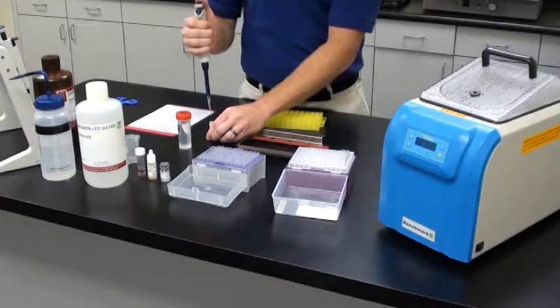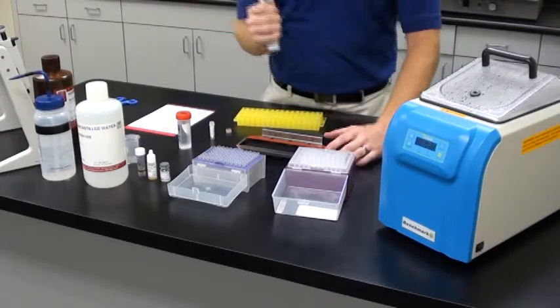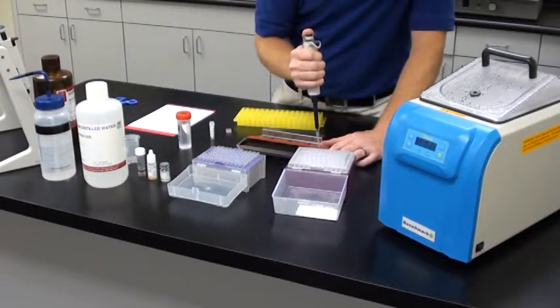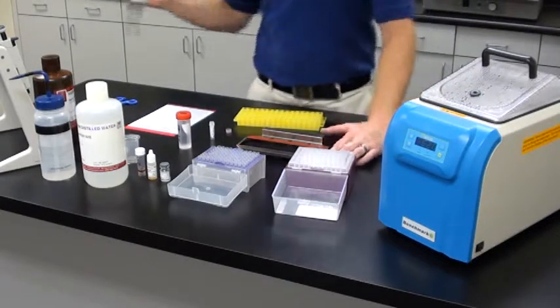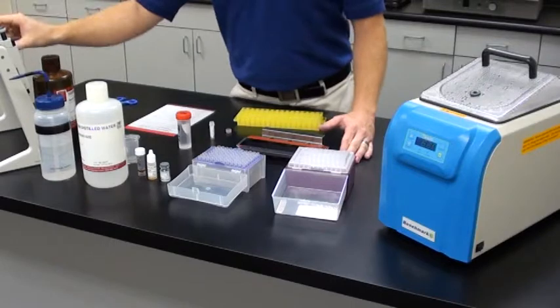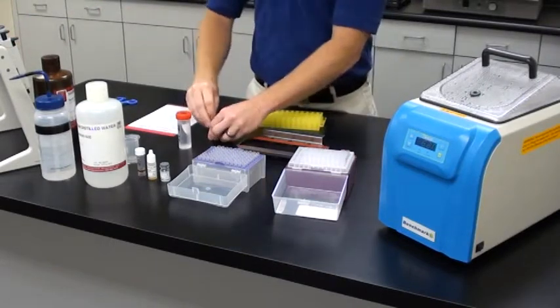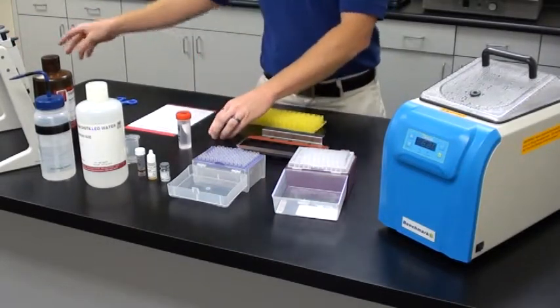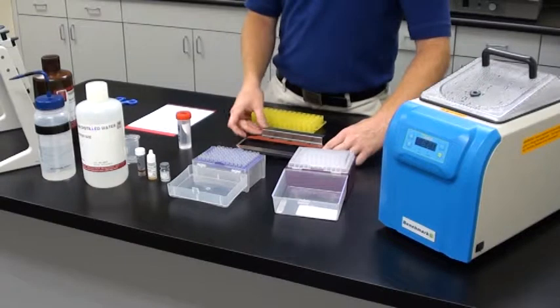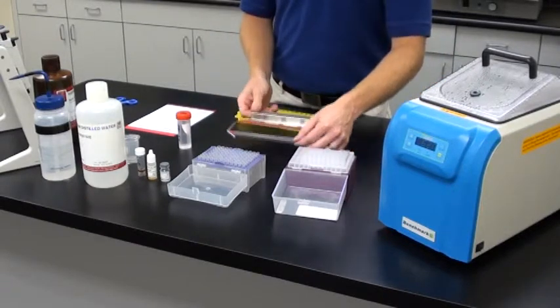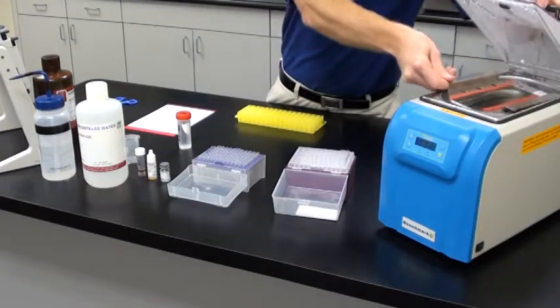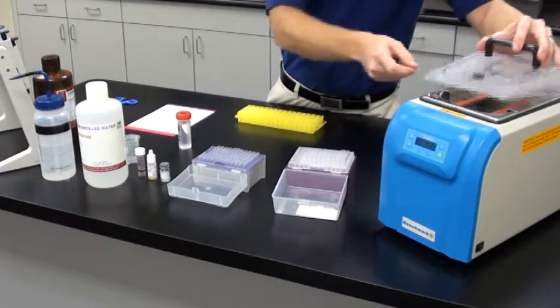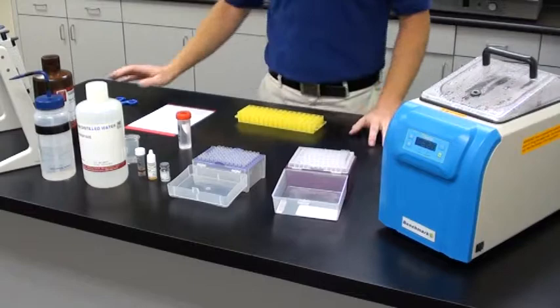Simply pipette out the 65 microliters of probe, and just as with the proteinase K, be sure to cover the entire tissue section. Once you've applied the probe to the tissue section, put it into your MyBath or your humidity chamber and into the oven, and allow it to hybridize for a full 60 minutes.